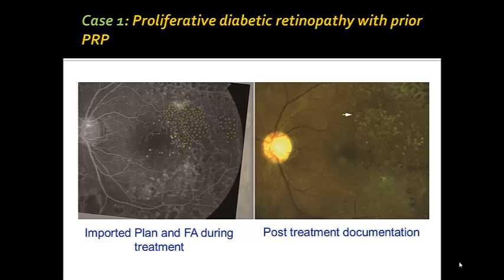The angiogram was imported into NAVALAS and superimposed on the retinal image of the left eye, and the treatment plan was created. The plan targeted both the neovascularization and the adjacent area of non-perfusion, avoiding the foveal avascular zone. Post-treatment documentation shows photocoagulation burns accurately corresponding to the pathologic areas. This patient remained stable at month 4.